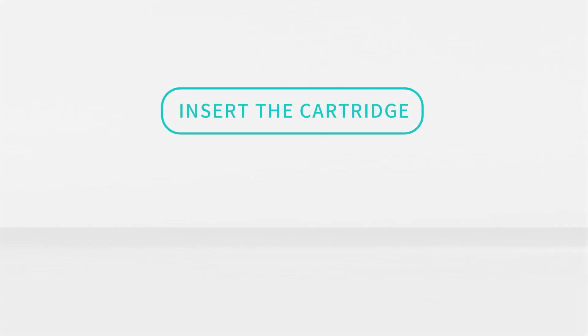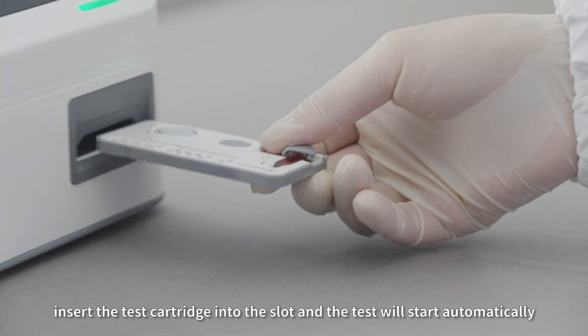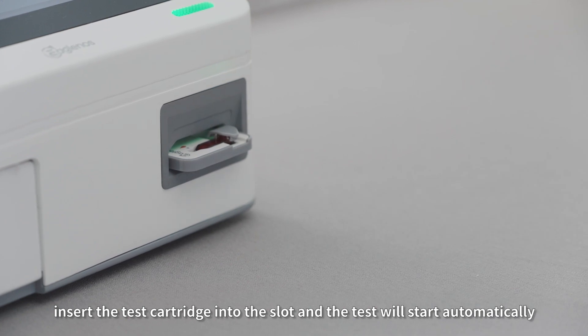Step 4: Insert the cartridge. Insert the test cartridge into the slot and the test will start automatically.